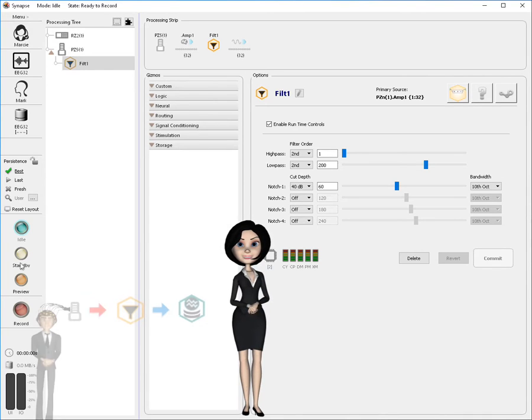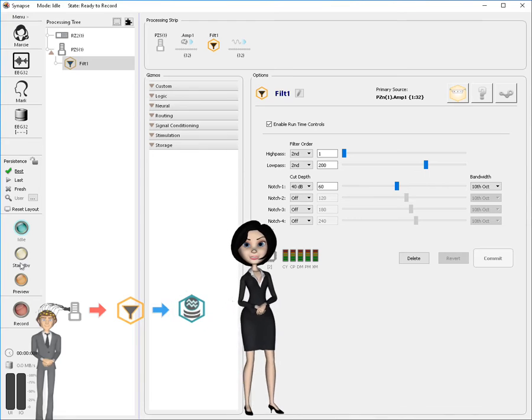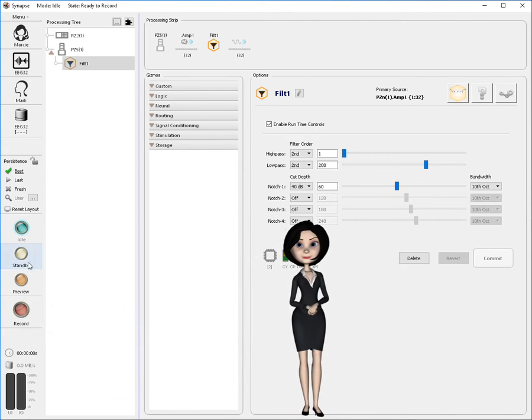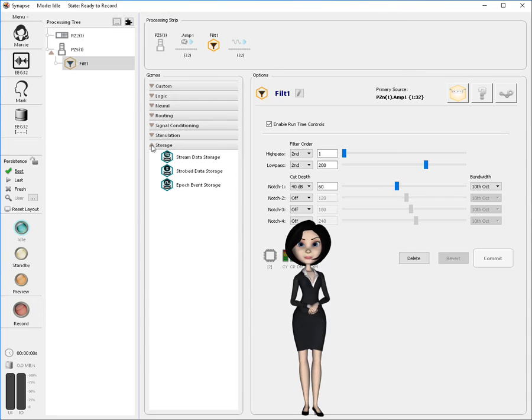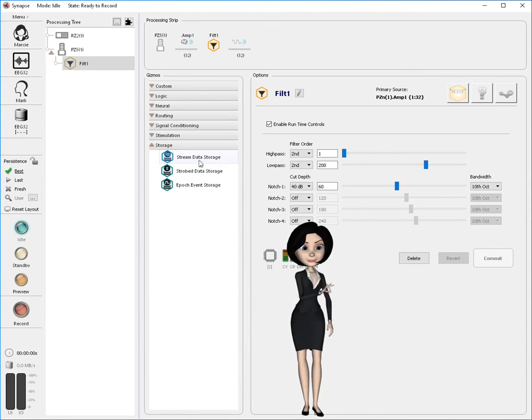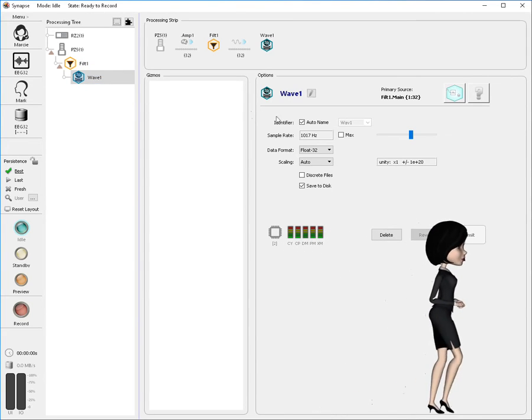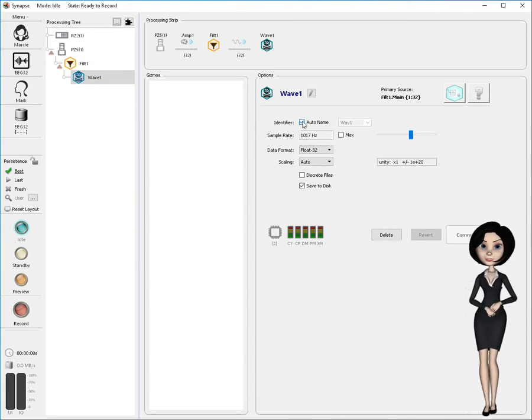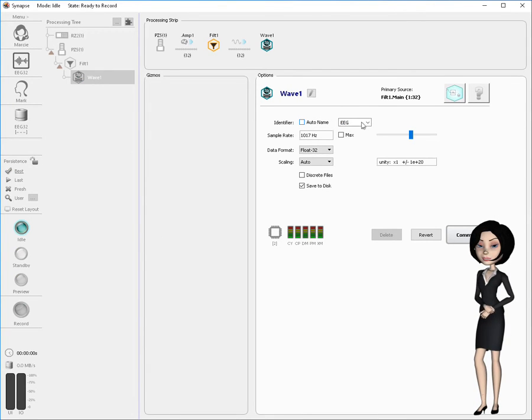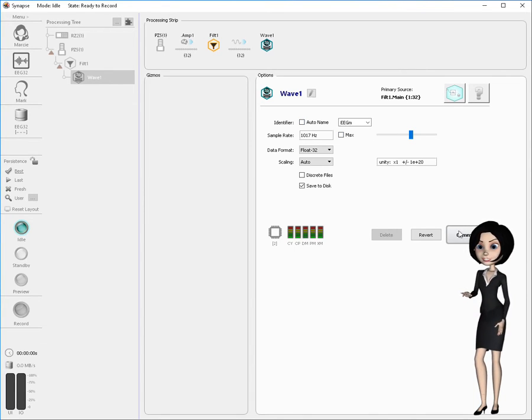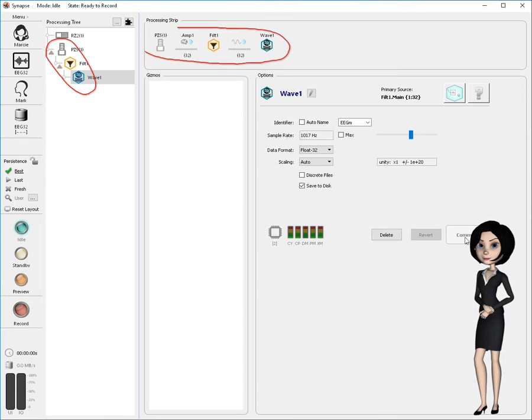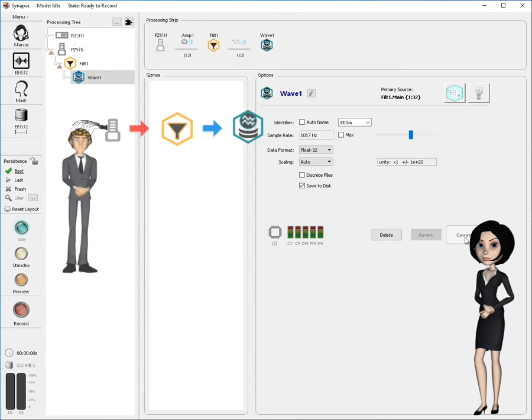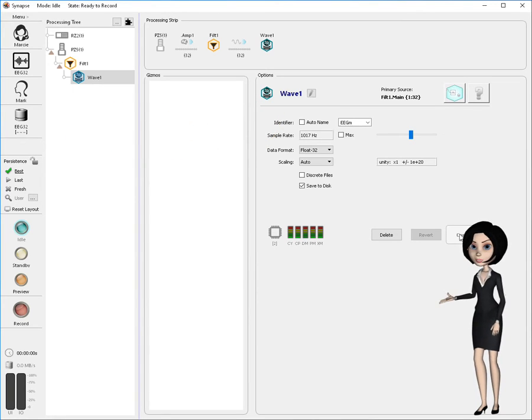Now we need to add a storage gizmo so our filtered EEGs will be saved to disk. Click the storage category in the gizmo selection panel. When it's revealed, drag stream store onto the FILT1 gizmo in the processing tree. Now we can make adjustments to the stream storage gizmo using its setup dialog. We'll change its four digit storage code to better match the signal type we are saving. Click commit to save these changes to the experiment. Looking at the processing tree and processing strip, we can see that the gizmo configuration here matches our intended experiment from part 1. This experiment is ready to run.